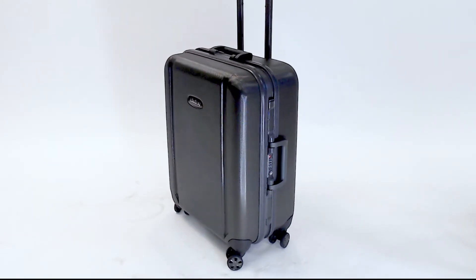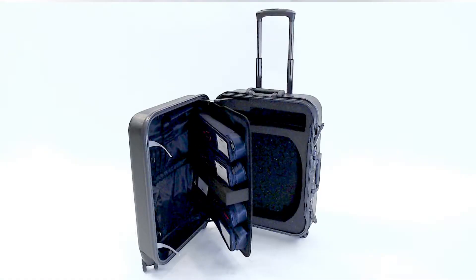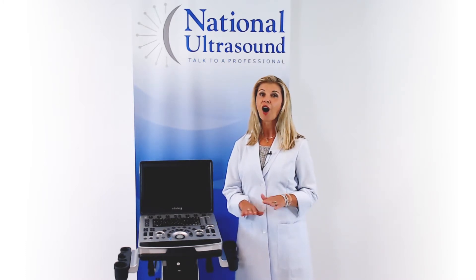The M8 includes a convenient rolling traveling case that can hold up to 4 probes. With its slim profile and ergonomic design, the M8 Elite is a powerful and versatile machine for all applications.